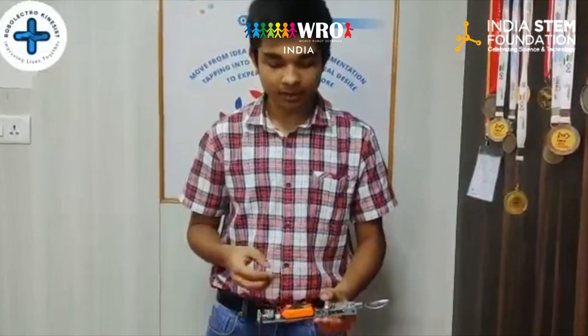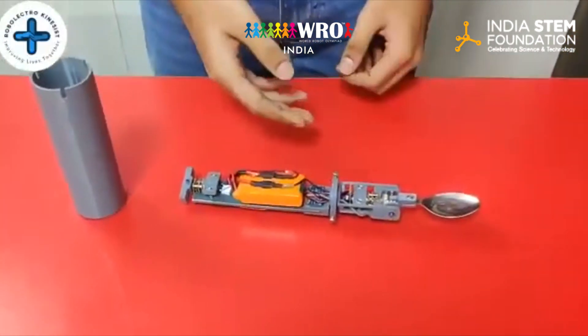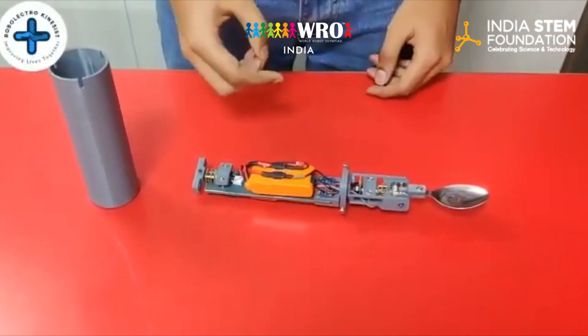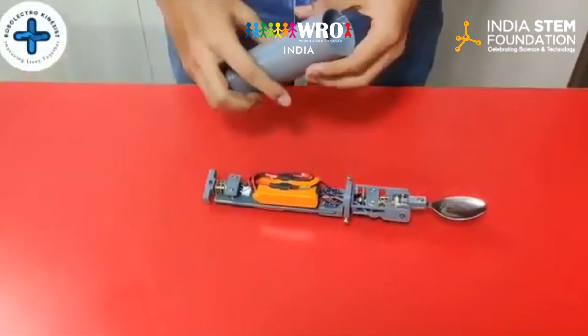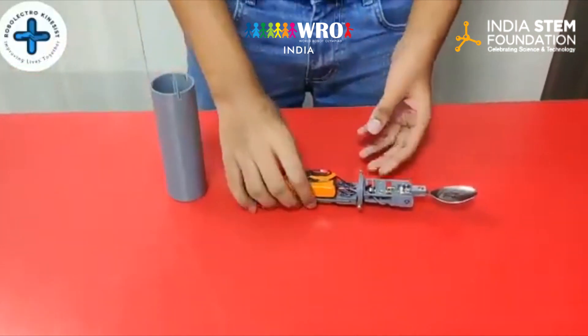Over the last one and a half months, we researched on the problem, talked to multiple experts in this field, and built many prototypes. This is our final prototype — the smart spoon. It measures the tremors faced by Parkinson's patients using the IMU and intelligently corrects for them using two motors, a microcontroller, and a battery. We designed all the prototypes in CAD and printed them using a 3D printer so that they can be customized.